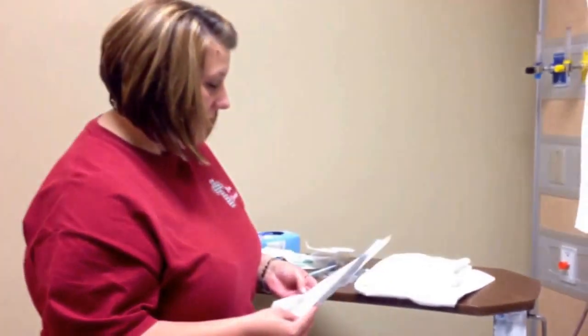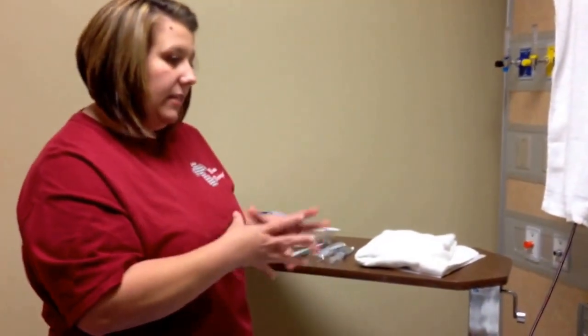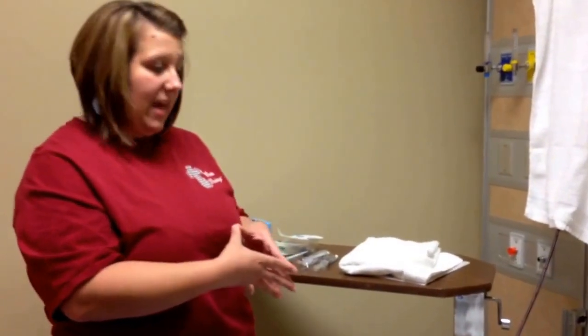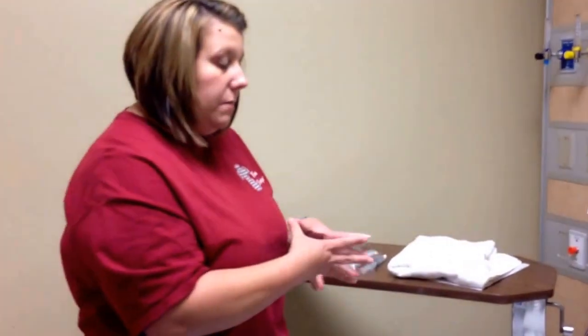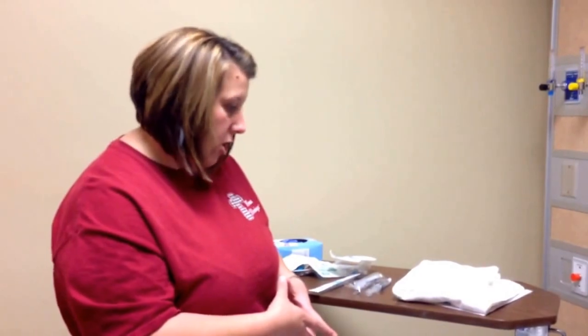Mr. Dunn, do you have any allergies? He tells me he's allergic to codeine. Do you have any allergies to latex or betadine? He says no. Since he's male, the mastectomy question doesn't apply, but you would ask a female patient. Have you ever had a dialysis shunt placed in your arm or any special IV catheter? He says no. Are you right or left-handed? He tells me he is left-handed, so I'm going to try with his non-dominant right hand first.